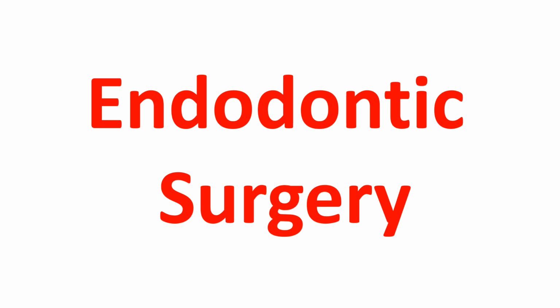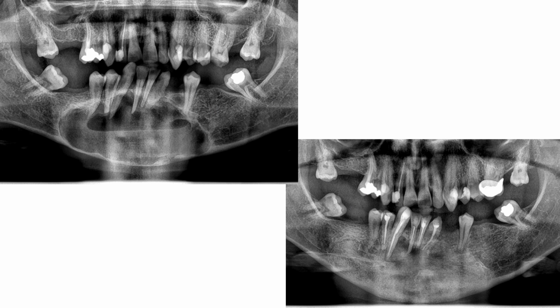Endodontic surgery. This was a very interesting case whereby I had a person sent to me after surgery, removal of a keratocyst. It was a very huge lesion, and it made 5 teeth non-vital.